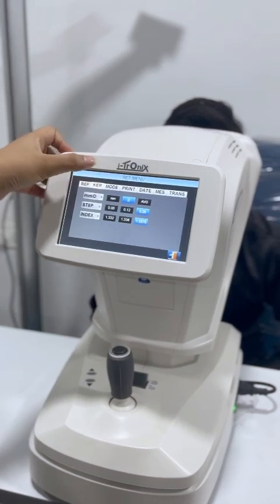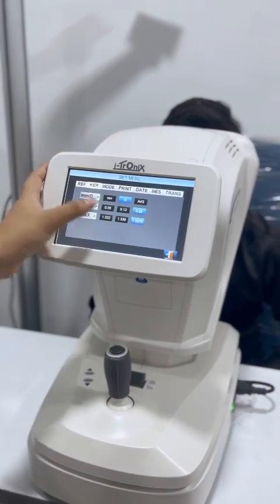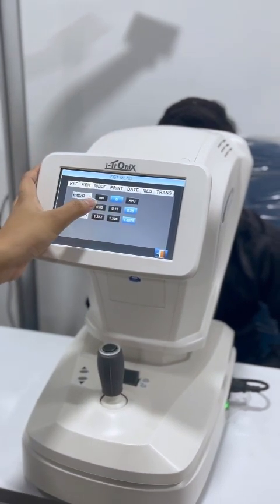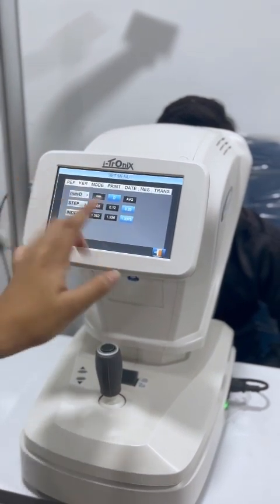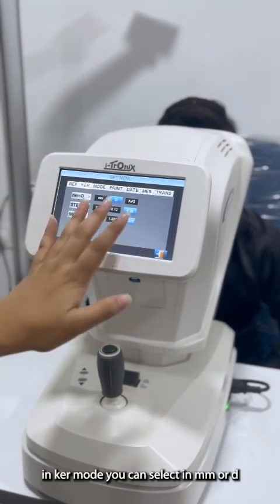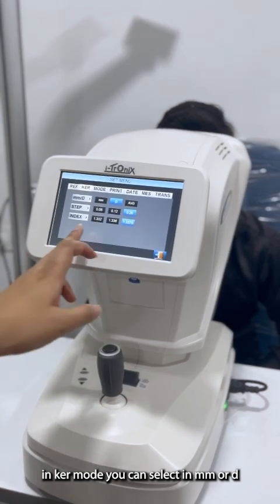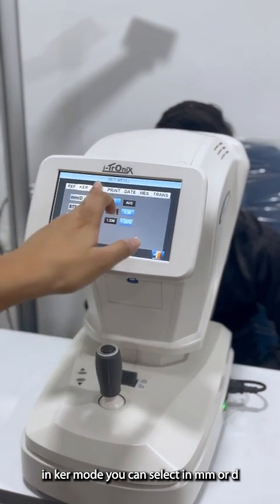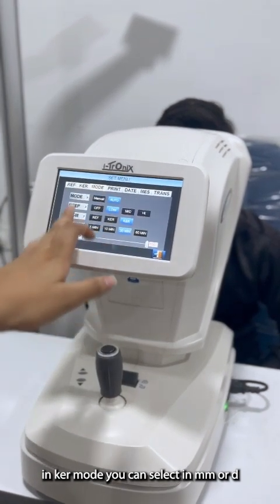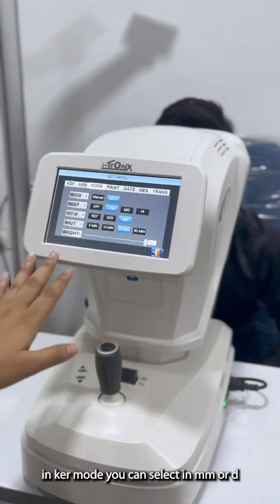In keratometer settings you can select diopter, millimeter, or average. We have selected the diopter value. And this is how it should be configured.